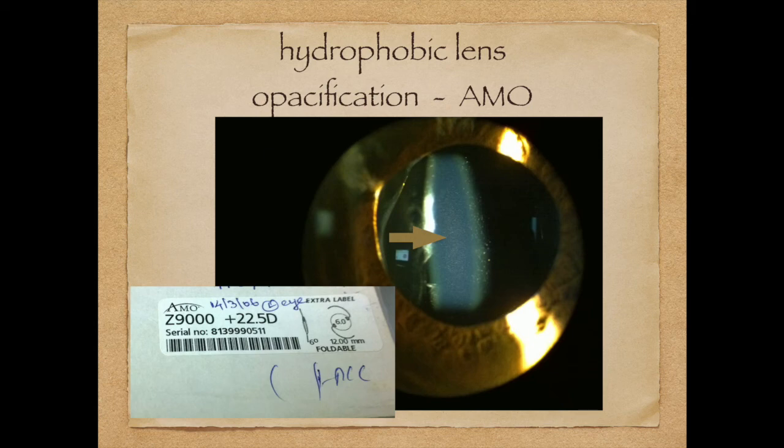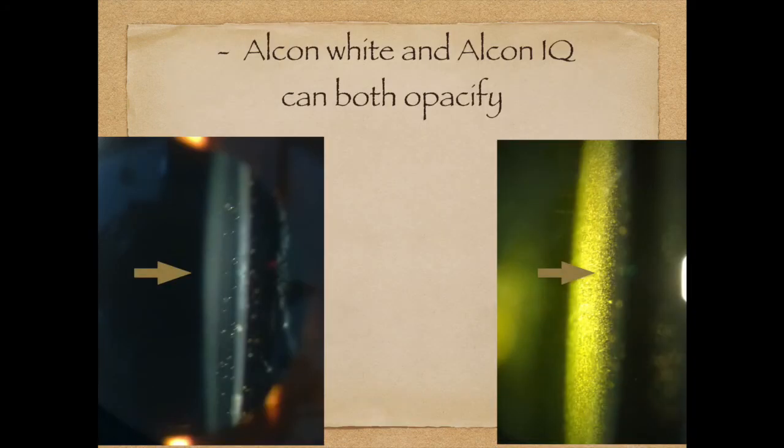This is a very rare picture of my overly opacified AMO lens. This is an Alcon lens showing severe glistening and some surface changes. Both the white Alcon and the yellow Alcon can show changes, so you have the option of seeing white glistening or yellow glistening.